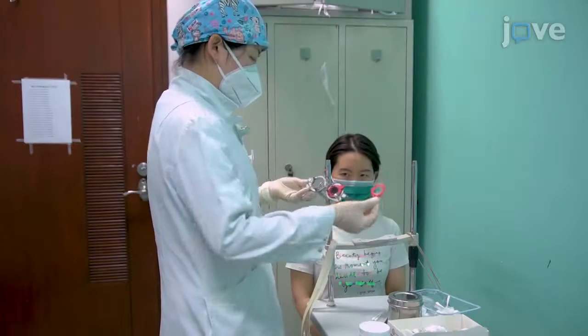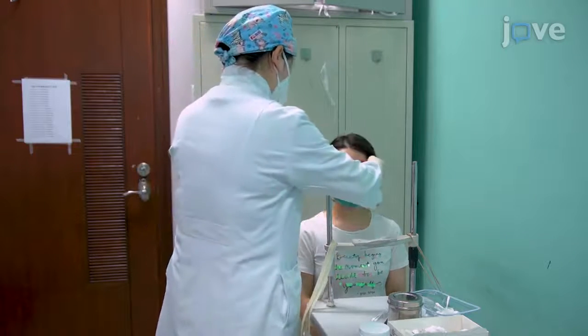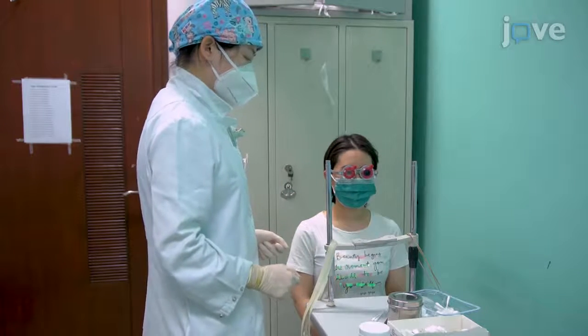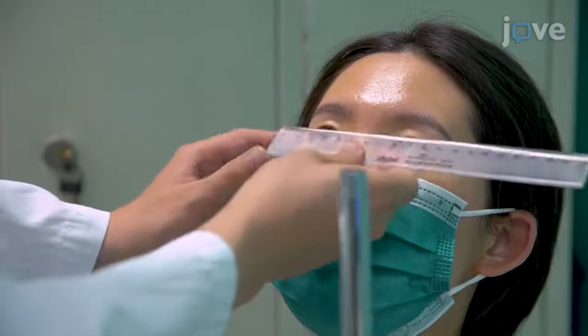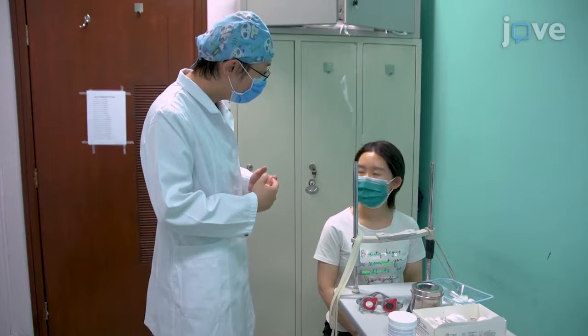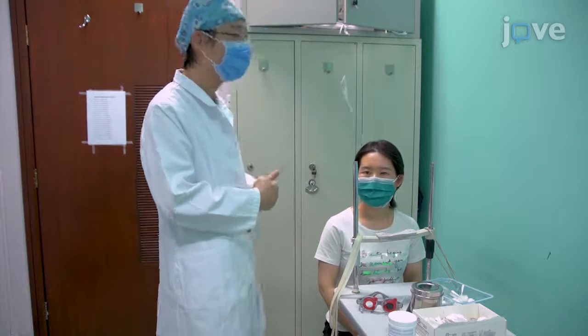To ensure the acquisition of reliable results, confirm that the refractive error is corrected to adapt for a distance of 114 centimeters, that the intraocular pressure is no more than 30 millimeters of mercury on the day of examination, that the pupil diameters are at least 2 millimeters and without mydriasis, and that each subject is at rest and quiet at least 30 minutes before the examination.